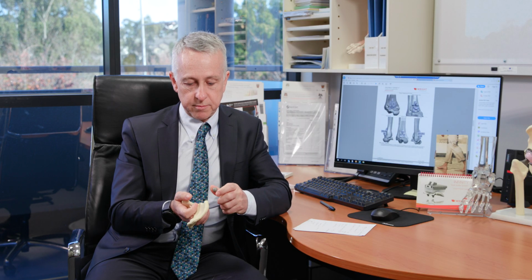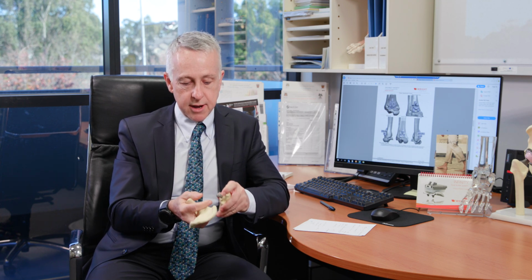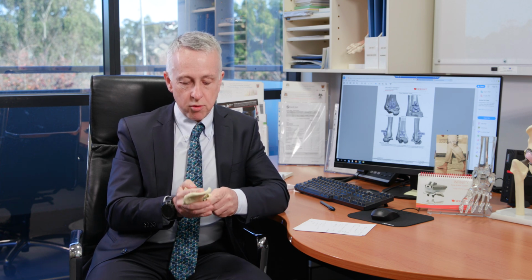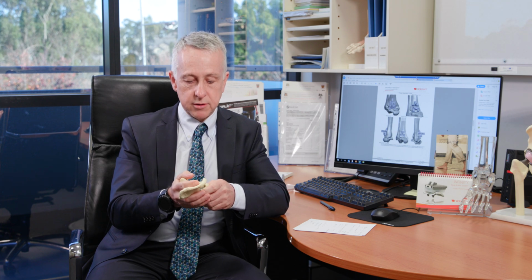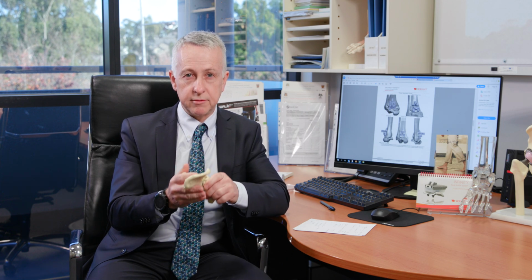Irrespective of the cause, the treatment for hip arthritis from a surgical point of view is a total hip replacement. And it's a very, very successful operation. It's probably the most successful operation in the history of surgery in terms of relieving pain and providing good outcomes for patients. So hip replacement is where we take the ball away and we replace it with a stem in the femur and a cup. It's called the acetabulum cup. And that ball articulates on the bearing surface. And that bearing surface can vary from ceramic to plastic, but that allows you to move and relieves pain.